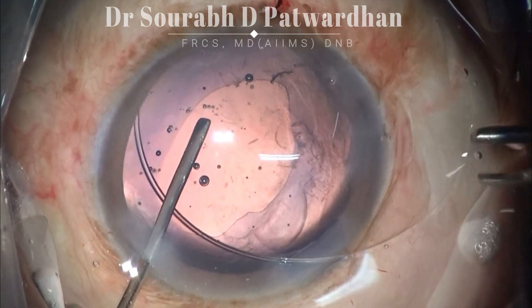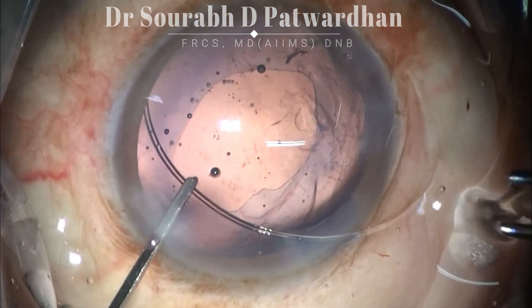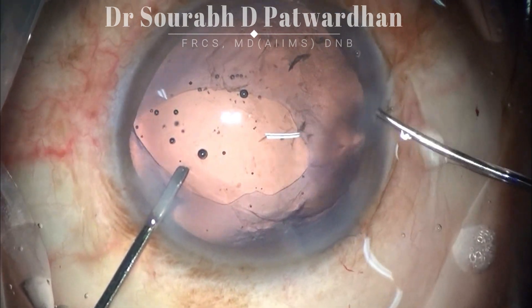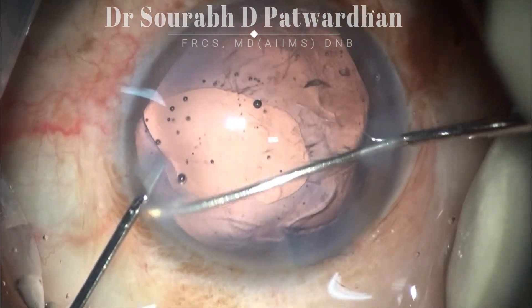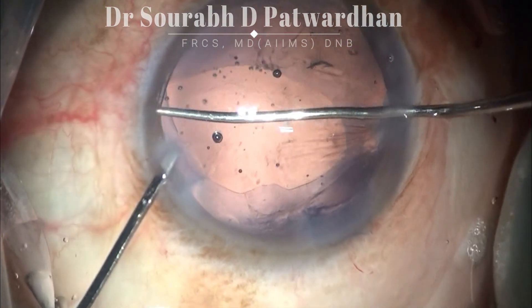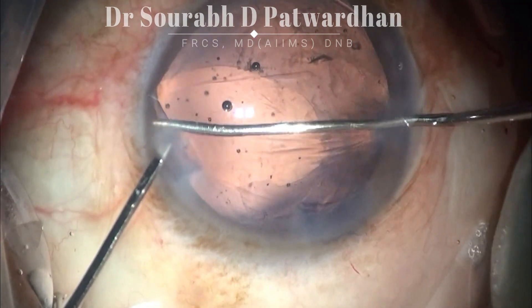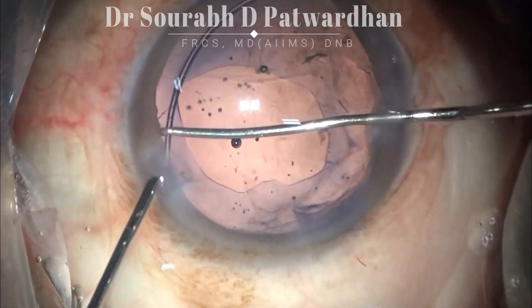In this case I am showing a difficulty in CTR segment insertion. The problem is that I am using a Sinski dialer to put it in and it slipped because I was using a very tiny dialer. Normally I use a 1 mm Sinski to dial it, but there is no need to worry. What I am doing here is simply circumferentially nudging the CTR very gradually. Be patient — don't try very harsh maneuvers. The CTR will slowly go inside the bag. If you try hasty maneuvers, you may damage the bag.